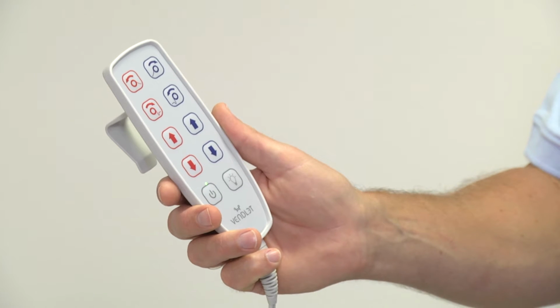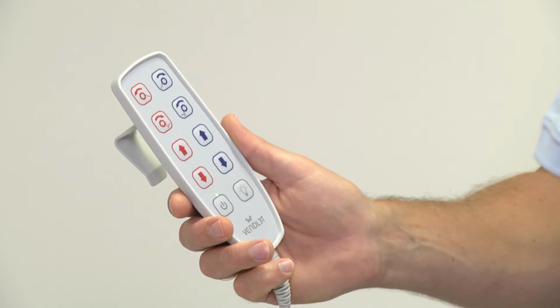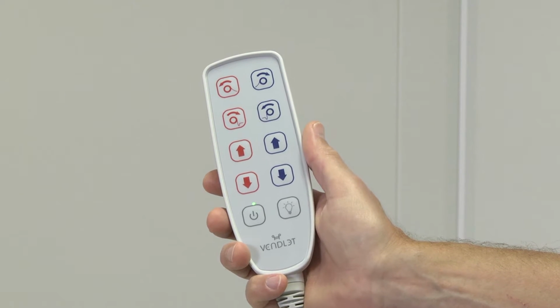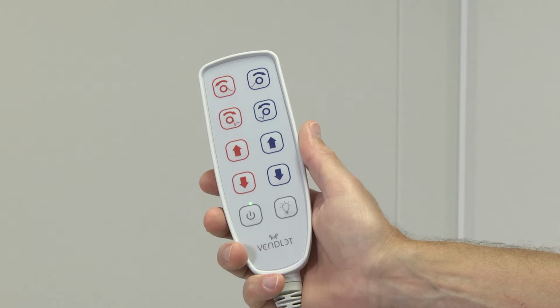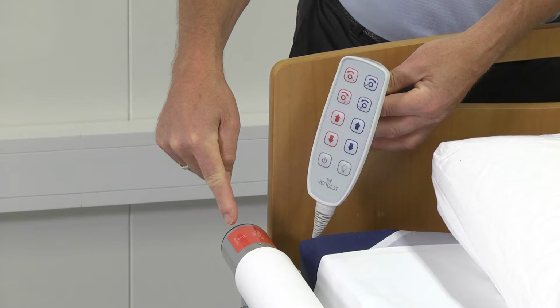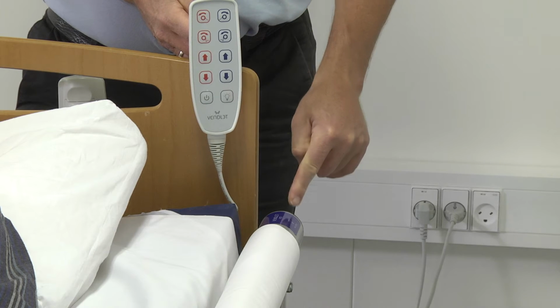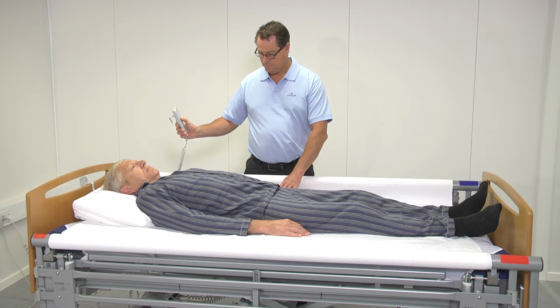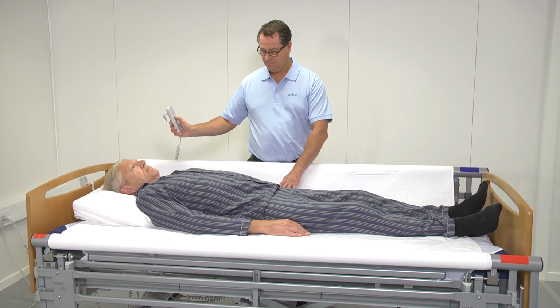When VENDLET V5S is activated by pressing the power symbol twice, the system produces a beep sound, and the green light above the power symbol is turned on. The red buttons activate the red bar. The blue buttons activate the blue bar. When VENDLET V5S has been activated, the bars can be raised.